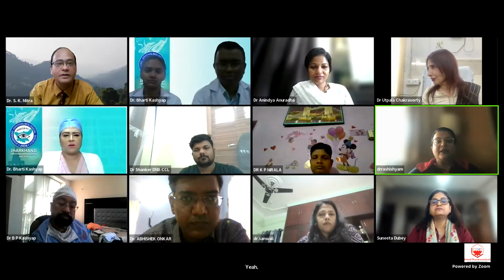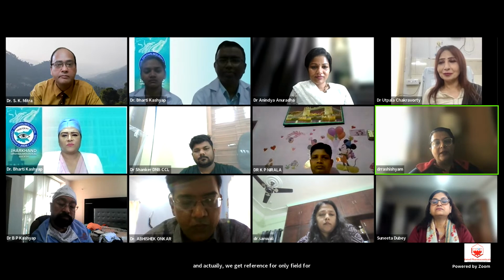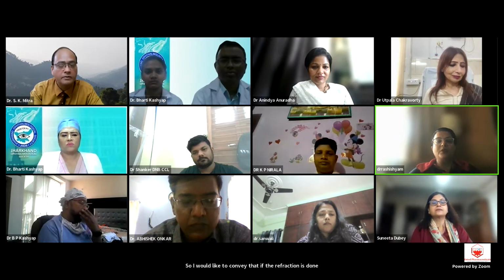Actually, we get referrals for only field. The patient has come only for the field test. So I would like to convey that if the refraction is done from before, it becomes very easy. The patient comes, the field is done, we report and send the patient back.